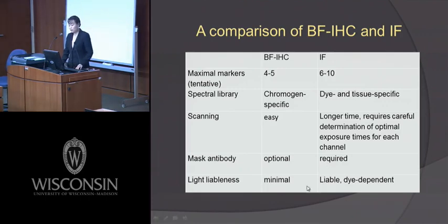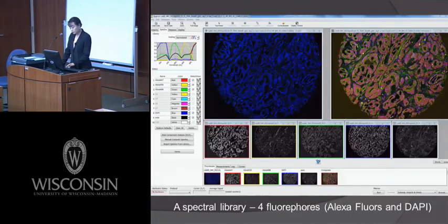Also, the other difference between these two assays is that fluorescent dyes are mostly photosensitive, so you have to choose a fluorophore that's relatively resistant to light. So in general, there are pros and cons for each assay, and you have to take all things into consideration and decide which assay to do.